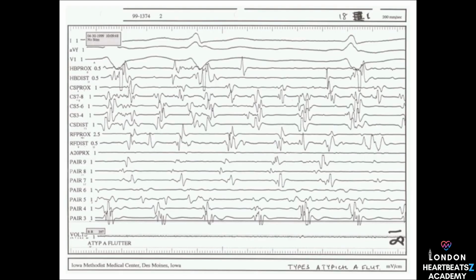Could be forming around an atriotomy scar. An atriotomy scar. Yeah, it's a scar left behind after heart surgery. Sometimes those scars can mess with the heart's electrical system, create these weird pathways that cause atypical flutter patterns. This figure is showing potential septal atrial activation, which means the signal's moving in a weird direction, maybe around that scar. So scars can really disrupt the heart's electrical flow.